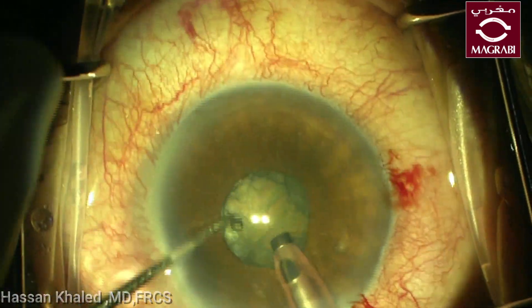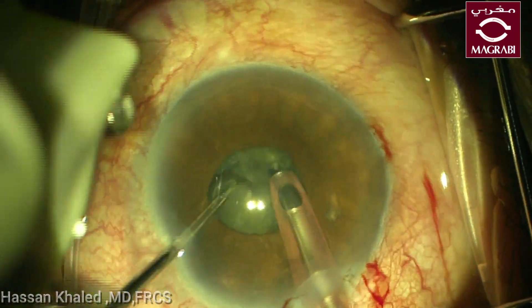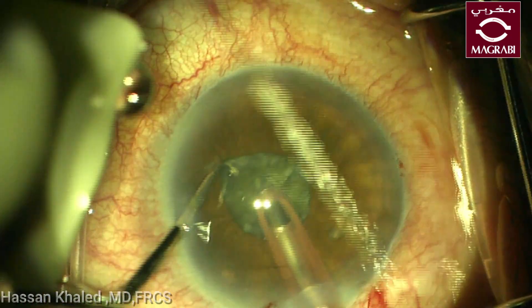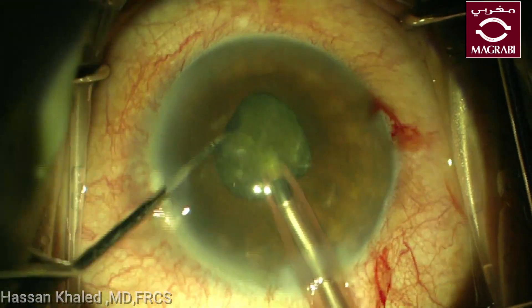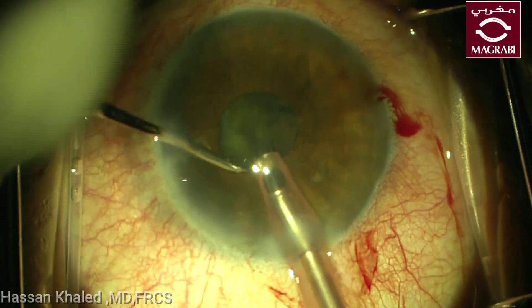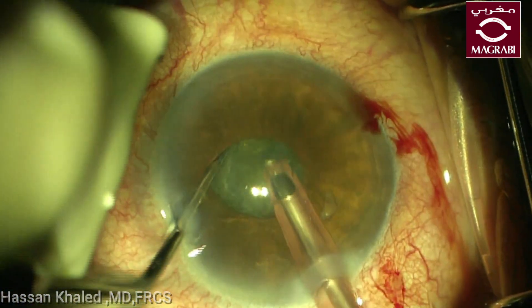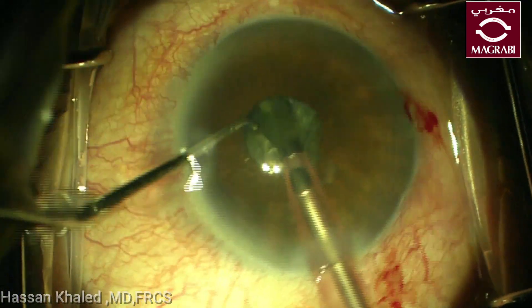Now doing the phacoemulsification of this nuclear cataract through this narrow pupil using the horizontal chop technique — holding the nucleus at the center of the pupil, then going with the chopper at the equator and chopping it into halves. Then you can chop each half alone into smaller pieces and emulsify all these pieces at the level of the pupil, as you see in this case.